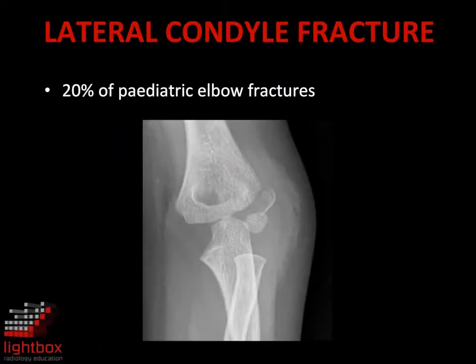Lateral condylar fractures are a less common fracture in the paediatric population. These appear as a linear lucency and/or cortical disruption involving the lateral condyle.